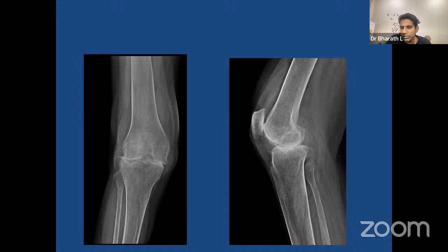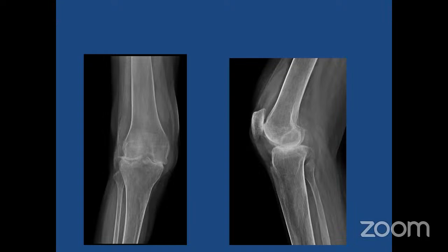I think this patient could be solved. 1 to 5 degrees residual FFD will correct over a period of time. Anything more to add? Yeah, I think, looking at the X-ray, the posterior condylar offset seems to be really low, even on the native X-ray. So I think you can expect some kind of flexion laxity in such kind of knees.